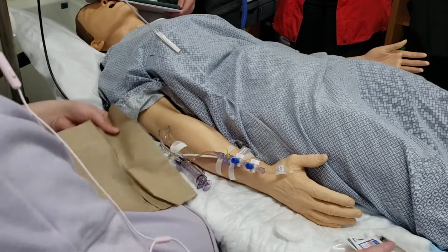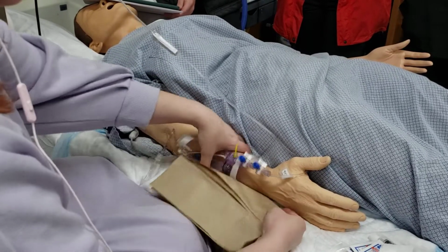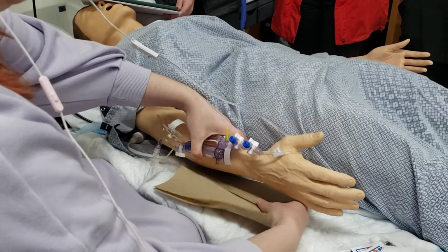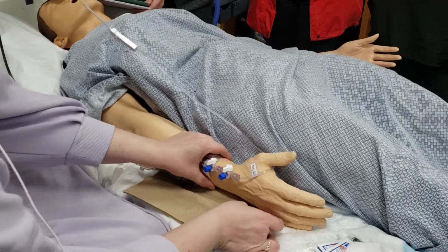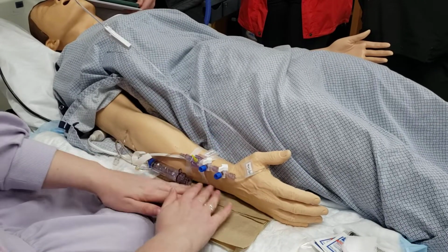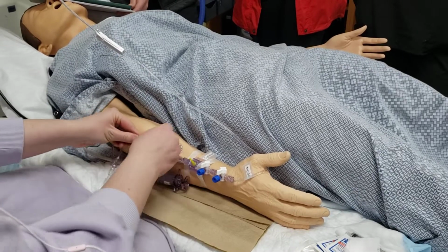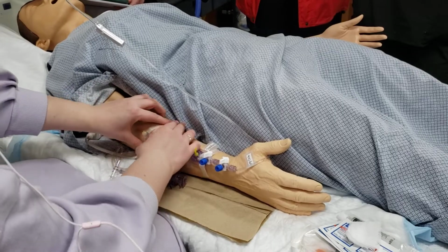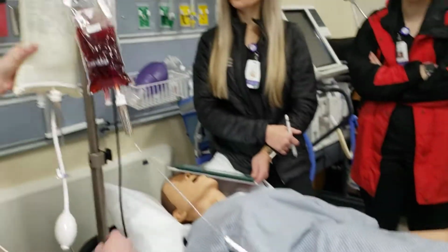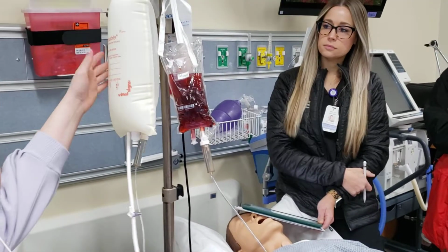The purpose of the paper towel is to put underneath my patient's arm where I'm drawing the blood gas from, so that if I drip on the bed, it goes onto my paper towel and not onto my linens. So we're going to start from the pressure bag up here, and then we're going to show the equipment and then we'll draw.